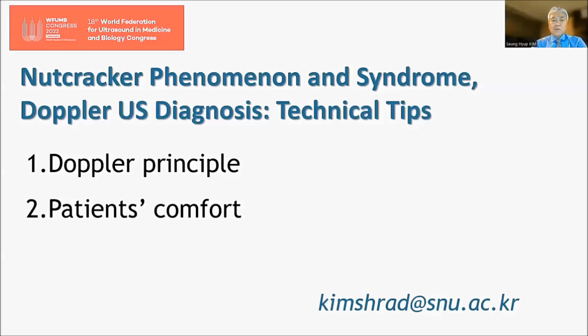Another point I want to emphasize is that the Nutcracker is not a fixed static condition, but is a dynamic phenomenon with posture and respiration of the patients. So please take maximal advantage of the dynamic capability of the ultrasound in Nutcracker Doppler.